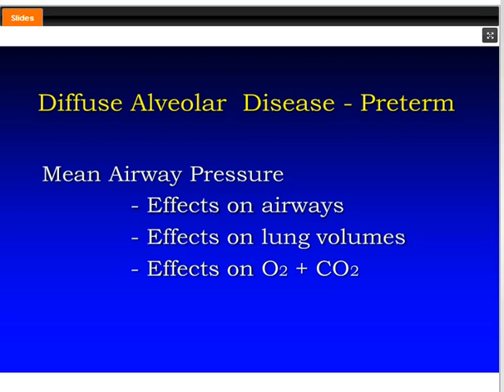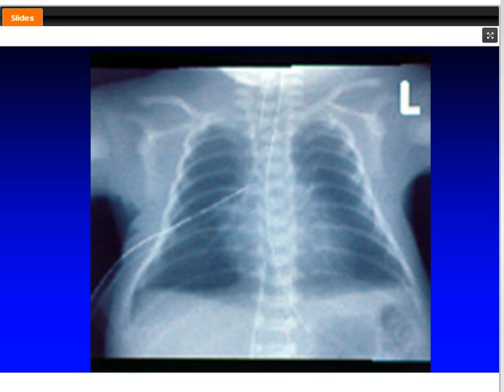But if you've allowed airways to collapse from that standpoint, you will have an alteration in carbon dioxide also, and if you overdistend the lung, you'll have an effect on that. So while the mean airway pressure's predominant effect is on oxygen, it can have an effect on carbon dioxide.